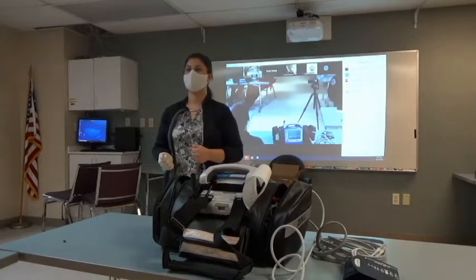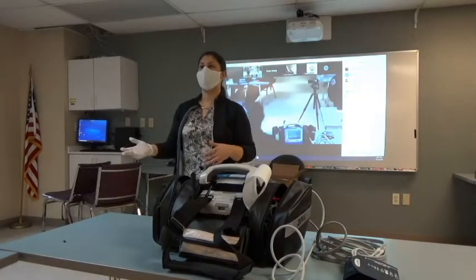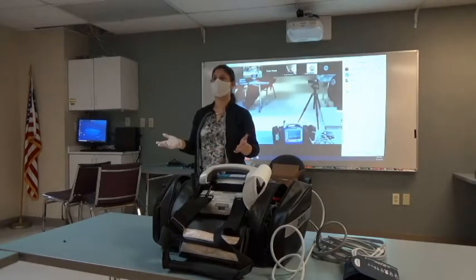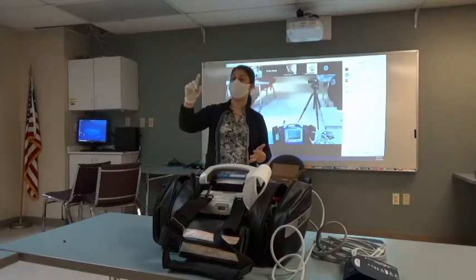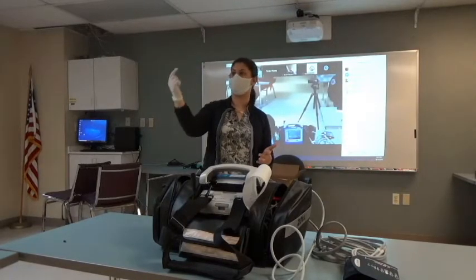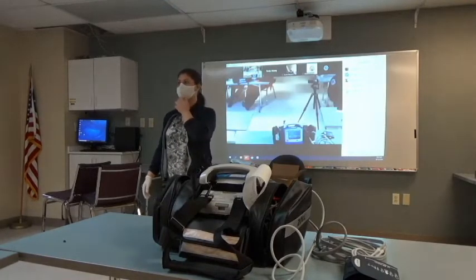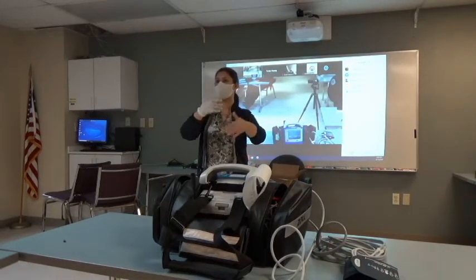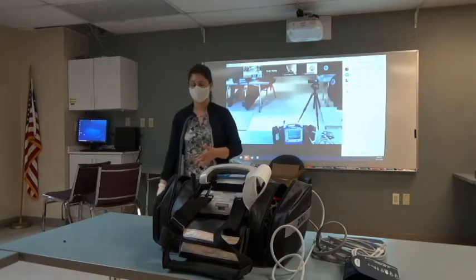So you're saying it's like purging liquids if they come close to the sensor? Vomit, blood. Whatever we see out in the field, right? When we're intubating, that may start to come through. We've all seen that, I'm sure, or heard about it to where it could back up a little bit. I think we resolved that problem because of the filters. So it's just something to keep in mind. If it senses that, it will reverse to try to clear it. If it can, great. If it can't, we'll replace that line.